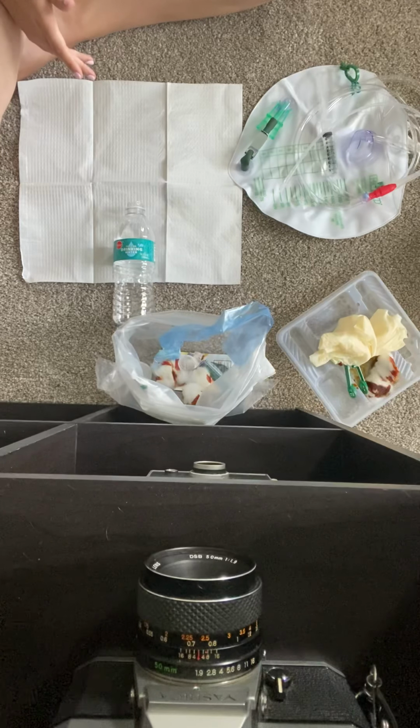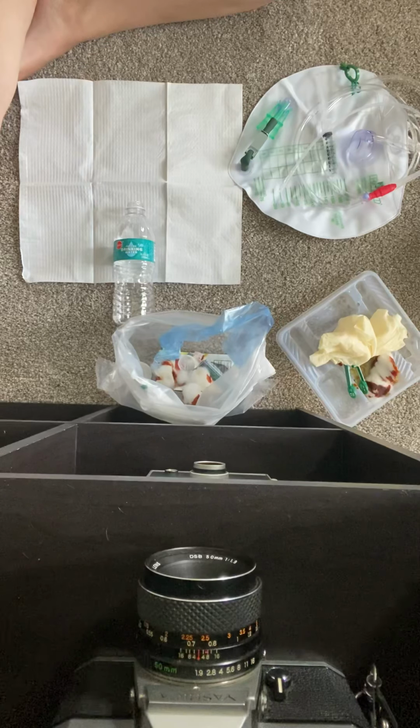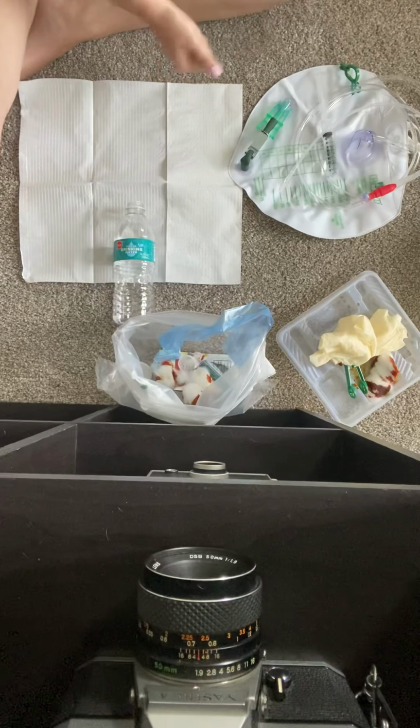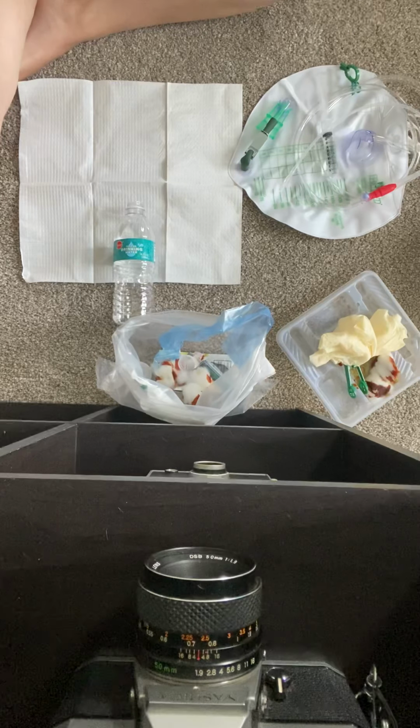And then you want to make sure, it'll ask if the balloon was deflated entirely before you took it out. That's important too, because you don't want to risk injuring your patient by not deflating the balloon all the way. Also, like I said, emptying the bag before you remove it, so you can take the whole bag and throw it away. You would want to document if you emptied it prior, if it was 400, then document that, the color of the urine, was it clear, was it cloudy, did it have sediment, did it have an odor? That's important to note too.